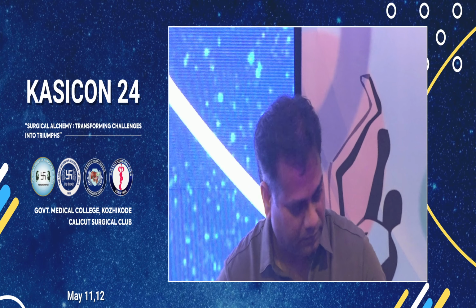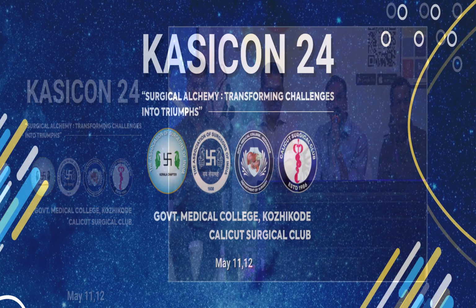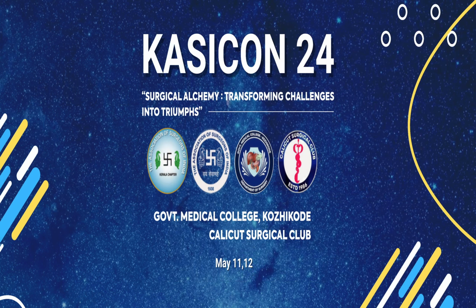Thank you. In answer to the question, for the juniors, one of the most dangerous weapons you can use is sharp metallic trocars. Nowadays many centers are not using them, but many small setup people will give sharp metallic trocars, and if you have not used them previously, they may injure inside. So be very cautious in using sharp metallic trocars and avoid them anytime if it is possible to avoid.